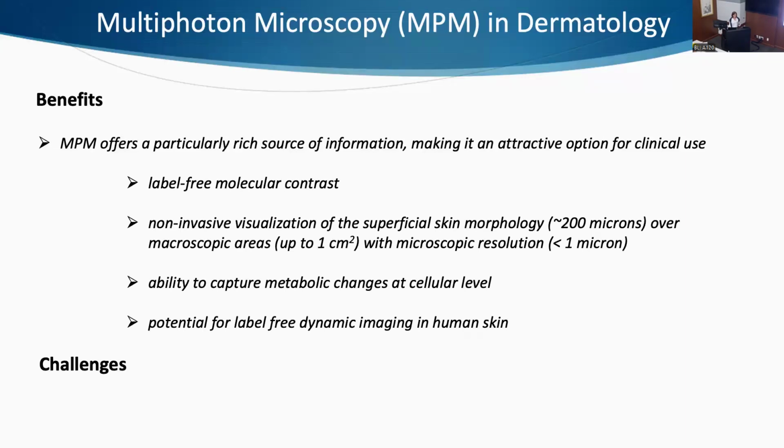I did not have time to go through that, but that's also a topic we are focused on. And there are always challenges and limitations. In the case of this technology it is the penetration depth, and Professor Potma touched on that this morning, explaining how scattering limits the penetration depth. And we still have to deal with limited specificity, because we do this label-free. But I always like to talk about these challenges as opportunities. There are lots of opportunities to work on this to address.